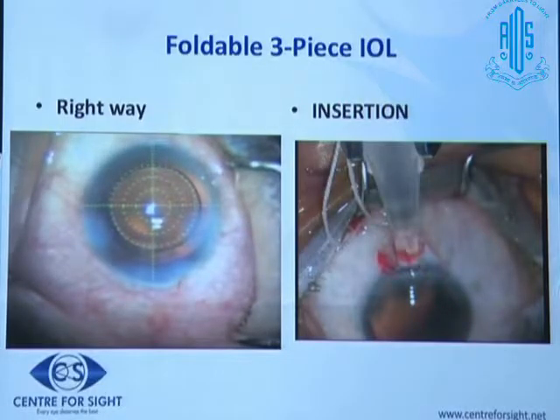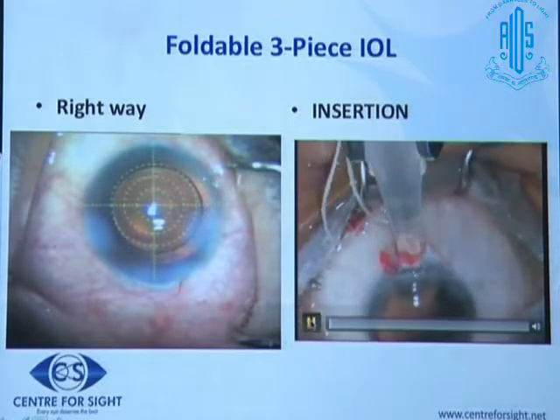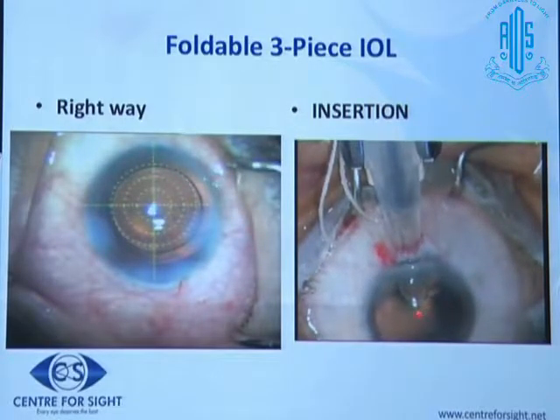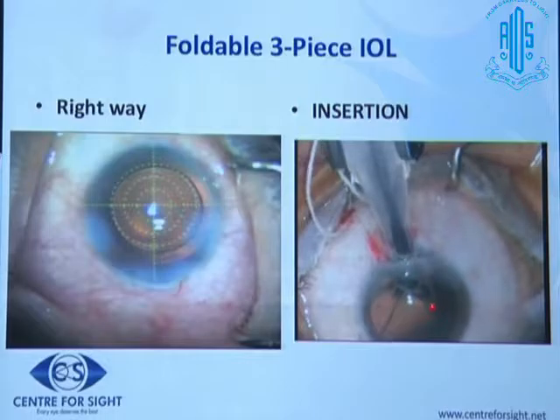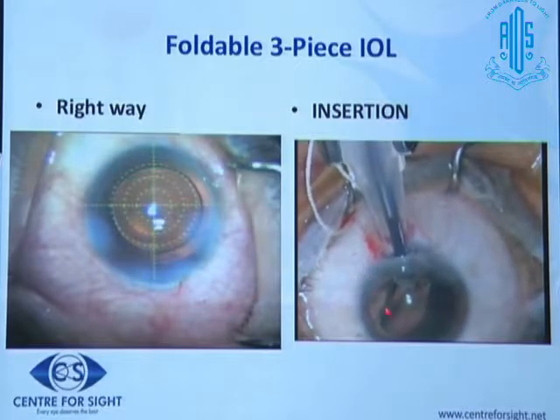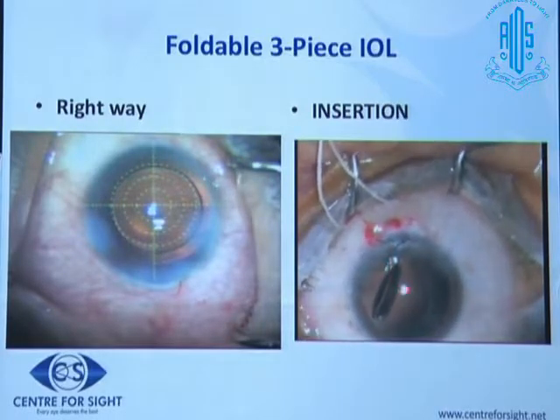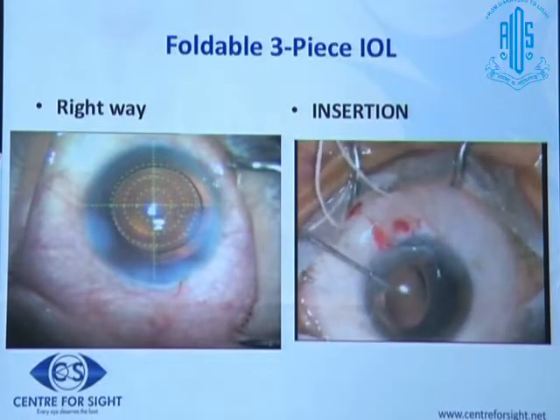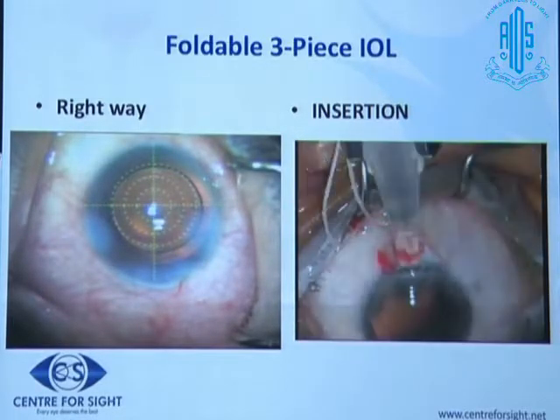Looking at this particular insertion, you can see the lens being inserted, but the person inserting does not perform a proper pronation movement of the hand. Because the hand is not being turned, the lens gets stuck in the incision and does not open in the proper way. When going in, you need to pronate your hand so that the lens opens properly into the capsular bag.